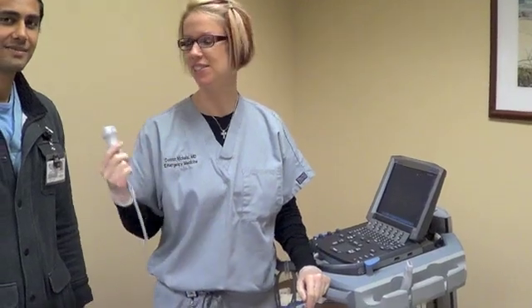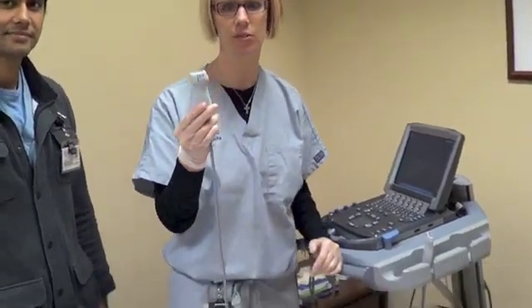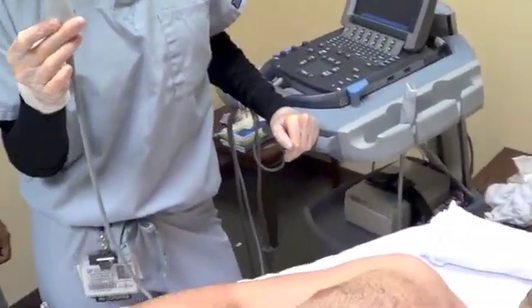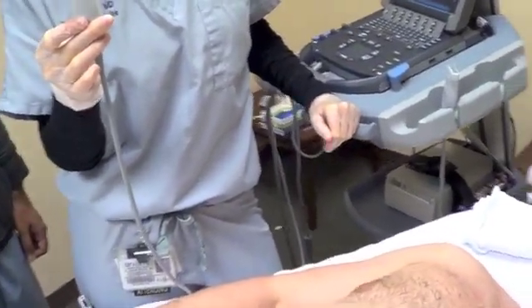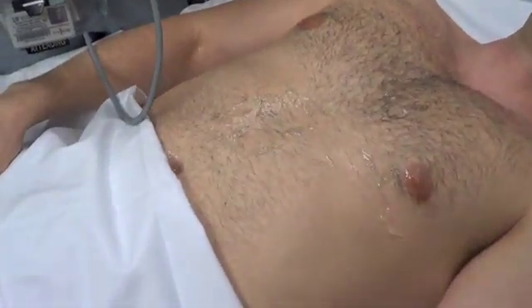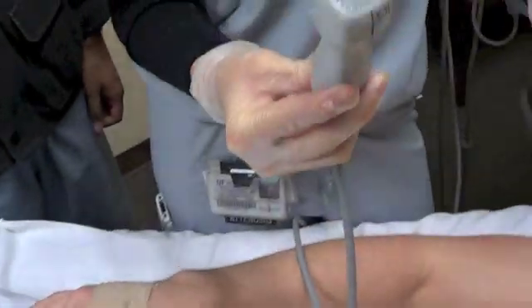Hi, I'm Connor Nichols, one of the emergency medicine ultrasound faculty. This is Adarsh, she's a medical student. We're going to do cardiac ultrasound — talk about probe position and the views that you're going to get. For cardiac, we use the phased array, also called our cardiac probe. It's five megahertz and has a narrow footprint that you can get in between the rib spaces.